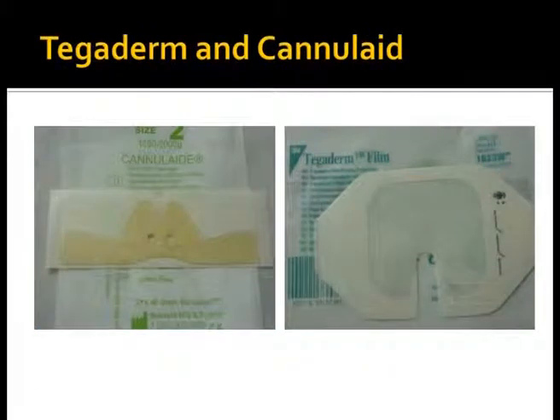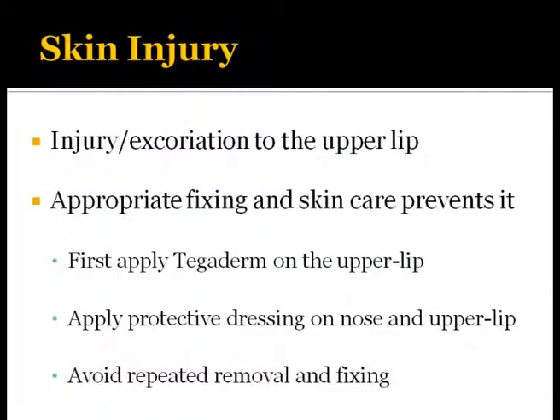A special cannulaid is available in various sizes to protect nasal septum from injuries. Observe the skin over the nasal septum area every 30 to 60 minutes for any change in color. At the first sign of hyperemia, prong needs to be repositioned, otherwise it leads to bad erosions. Normal saline or sterile water needs to be instilled at each nursing care. Ensure patency. If required, it should be suctioned at regular intervals.